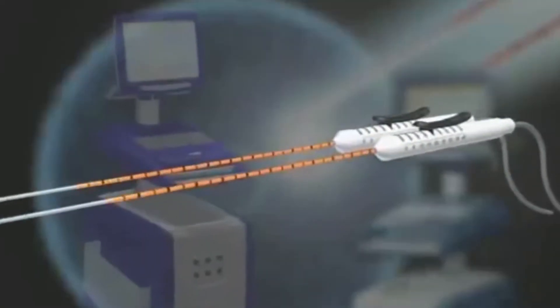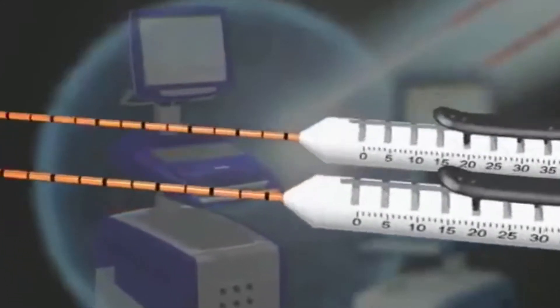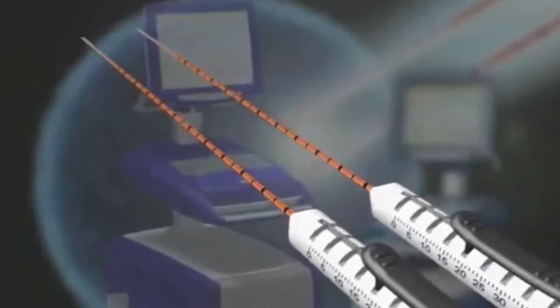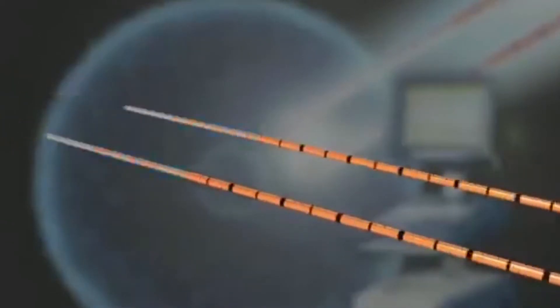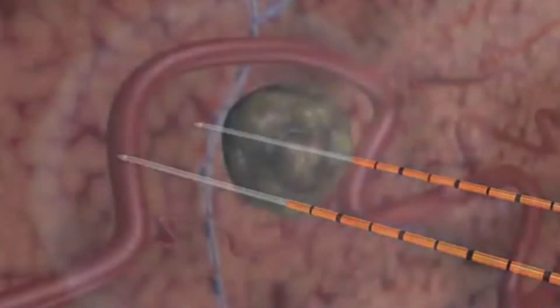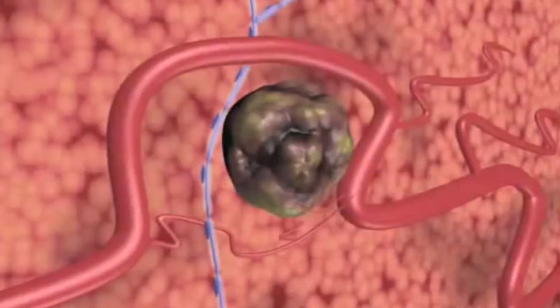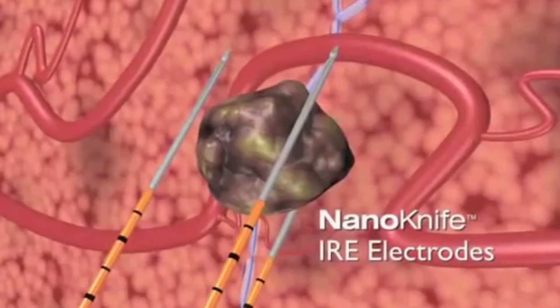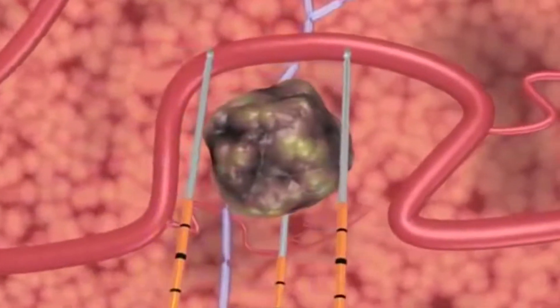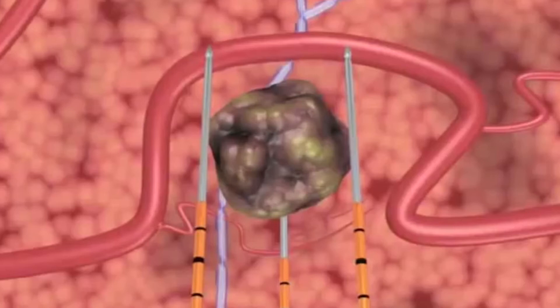The NanoKnife IRE Surgical Ablation System is the first to use irreversible electroporation, also known as IRE, to treat soft tissue lesions. Two or more NanoKnife IRE disposable electrodes are positioned in or around the lesion, and an electrical field is created between them in a series of microsecond pulses, which induces cell death in the encompassed soft tissue.